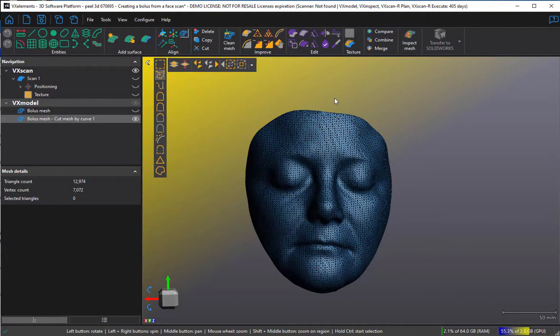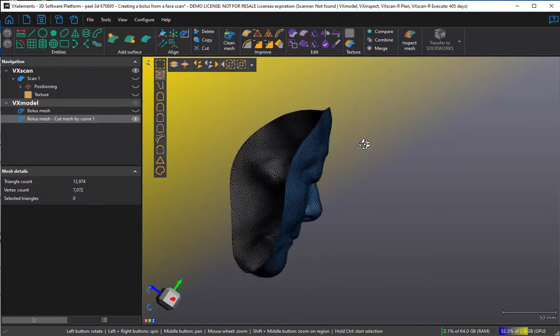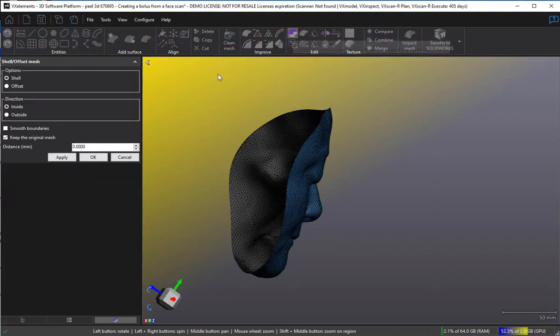The next thing we're going to do is extrude it, because this is a zero-thickness surface. We're going to extrude it using the shell offset mesh function. All that does is let me offset it to the inside or the outside. This surface is the accurate representation of the face, so I'm going to offset it to the outside so the inside remains the good fit. Then it's just a matter of specifying the thickness — I think one millimeter would be enough, maybe two in your bolus application. I just do apply.